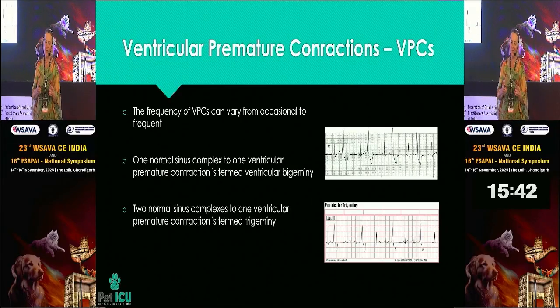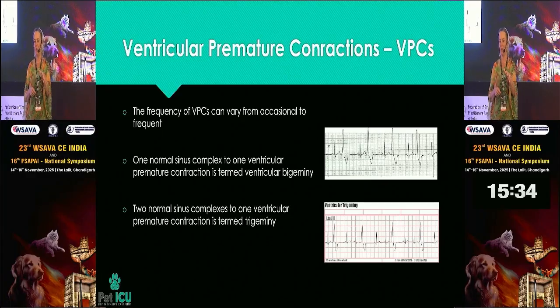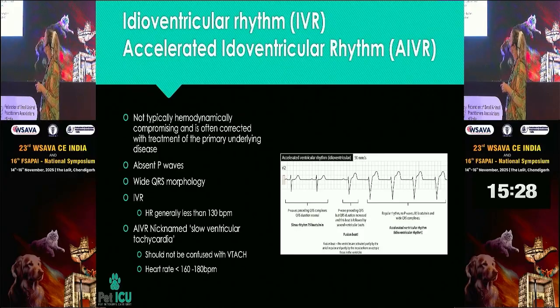You can get ventricular bigeminy, where it's kind of consistently taking over, and it's going beat for beat, one with the atria and then the ventricle, or trigeminy, where you'll get 2 normals and then one from the ventricles if you're describing these rhythms.